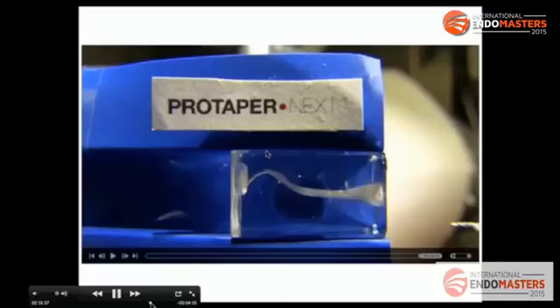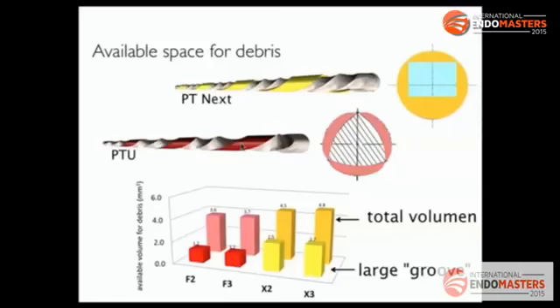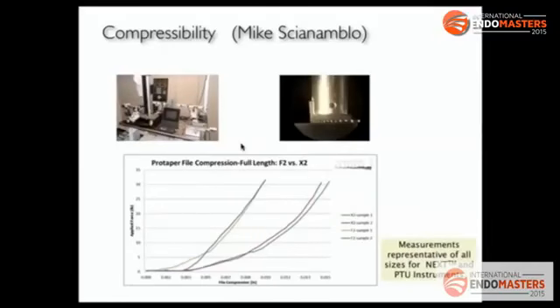So although the instrument is small, when we are in a great curve, the performance of the file is going to be as a big file. So when we are with a big instrument, or with a really curved canal, we have to go with the last files just to working length and out. Don't go in and out many times, because we are going to transport to the exterior of the curvature, or we can break the file by cyclic fatigue in the point of maximum curvature. Here we can see also the space between the flutes. These spaces are important because we have bigger spaces with ProTaper Next, and here we can remove the rest of dentin while we are working in the canal.